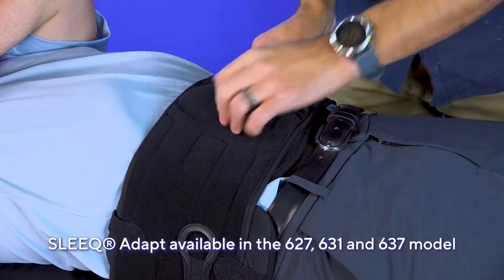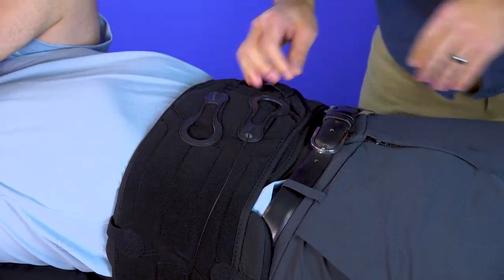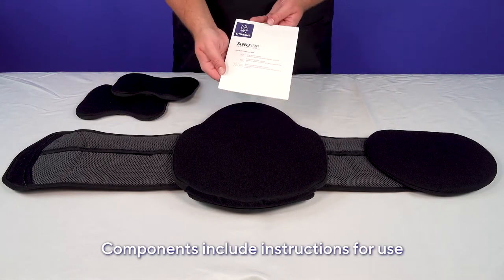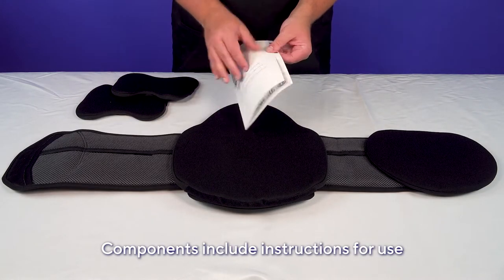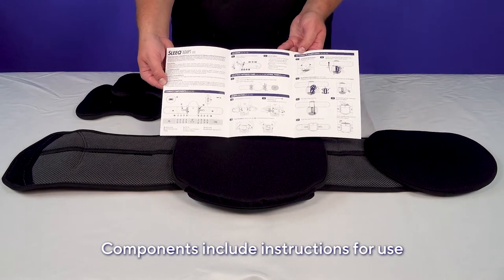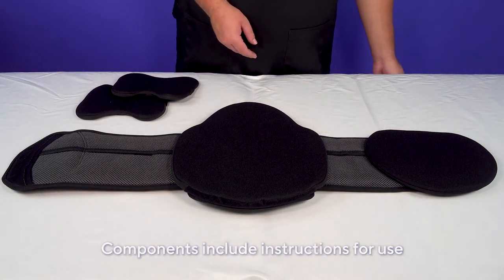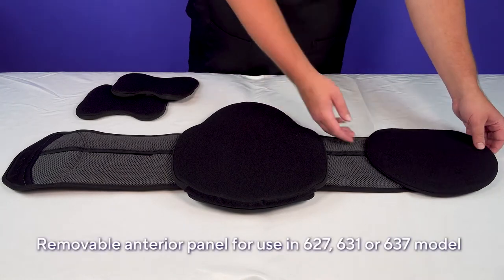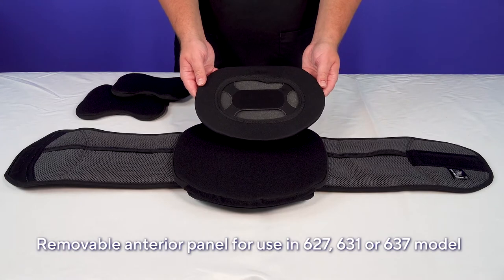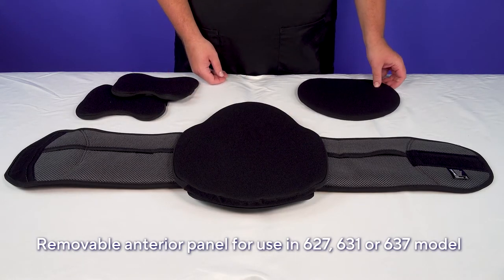Use the Sleek Adapt in the 627, 631, or 637 model. Components include instructions for use to help you fit and modify the brace for your patient's unique morphology, and a removable anterior panel secured with Velcro for use in the 627, 631, and 637 model.